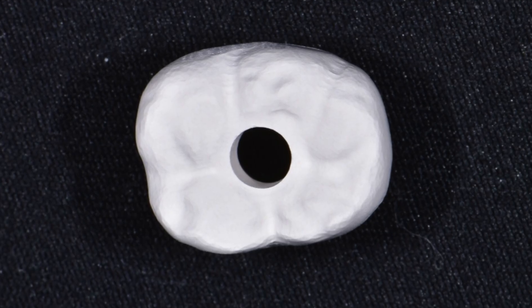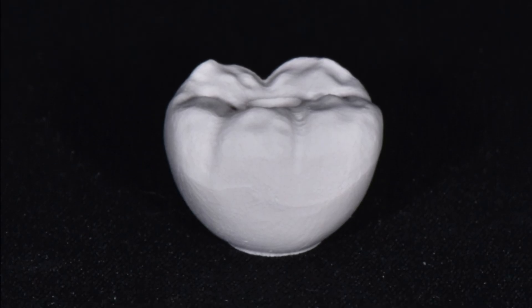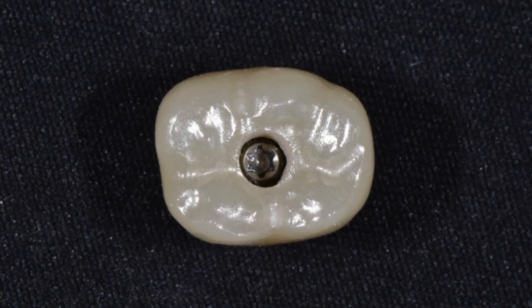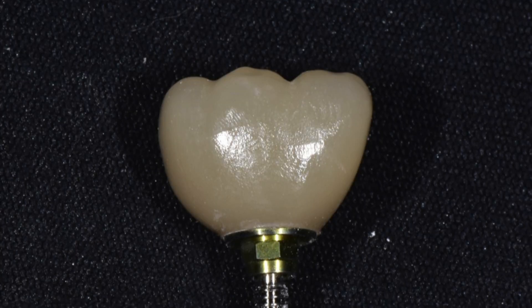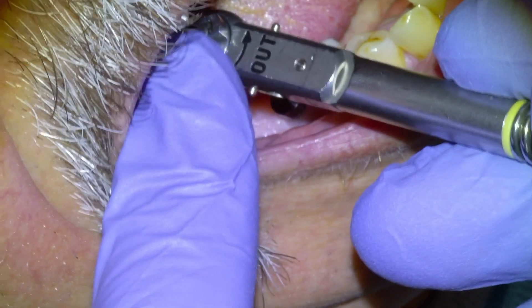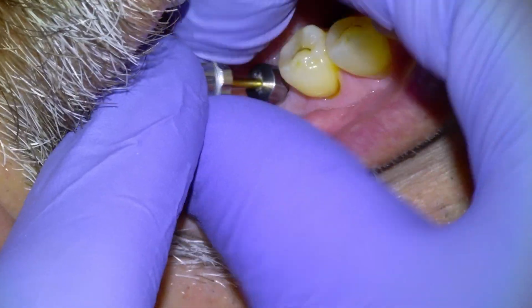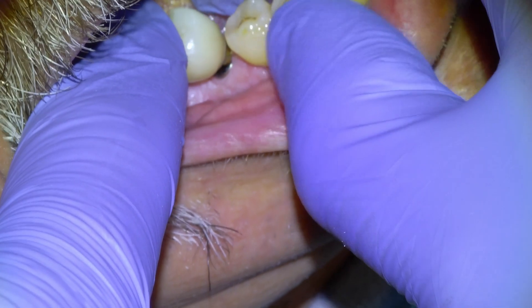After it's milled, that's the green state product before it goes into the sintering furnace. There's the implant crown with some other cases after it's been sintered. We polish it and then bond the gold adapter — it's a DES aurum ti-base — and they give about 20 to 25 degrees of insertion freedom, which is nice. It wasn't too much of an issue in this case, but I use those about 95% of the time.